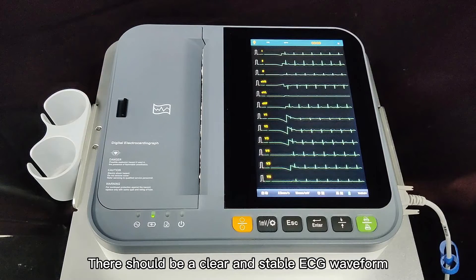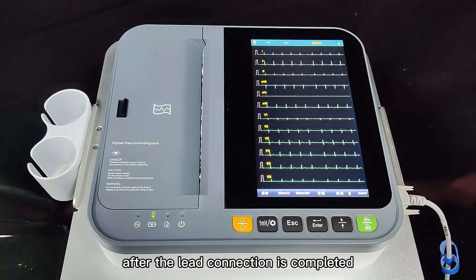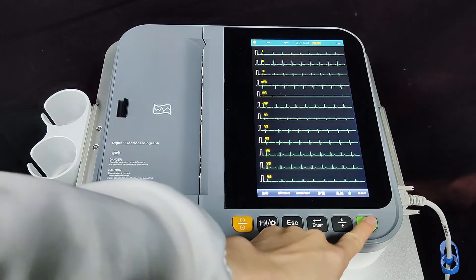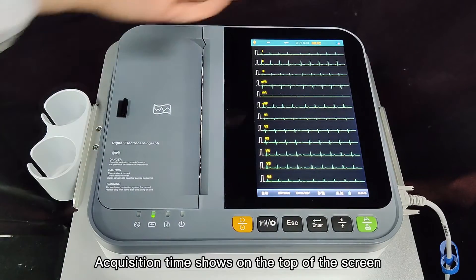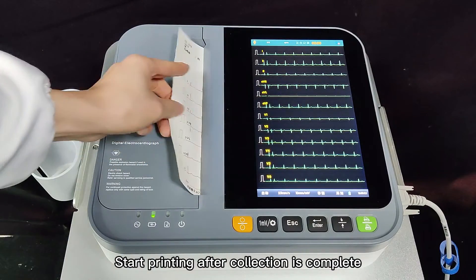There should be a clear and stable ECG waveform after the lead connection is completed. Click the green print button to print. Acquisition time is shown at the top of the screen. Printing will start after collection is complete.